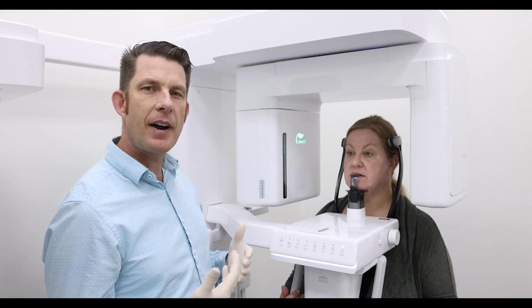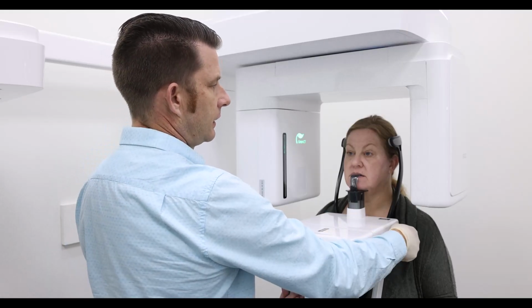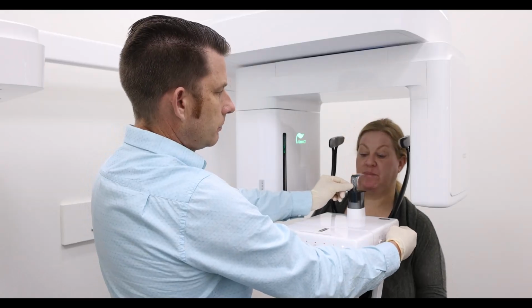The instructions I provided the patient is I'm going to go ahead and open the temple supports and have them go ahead and step back and out of the device.